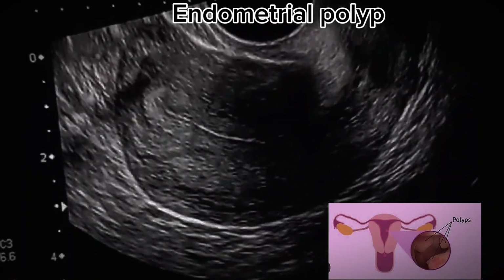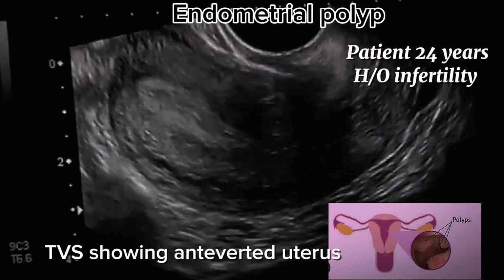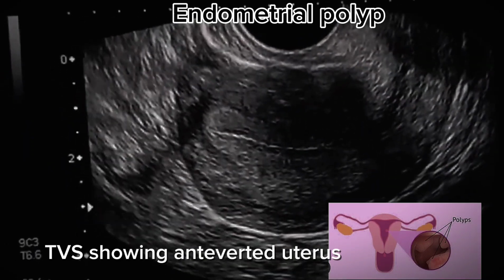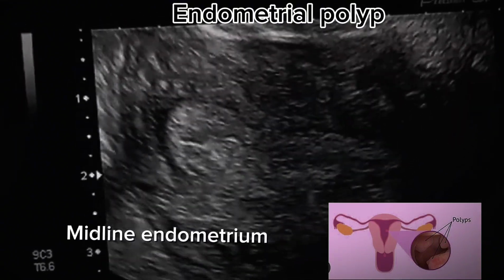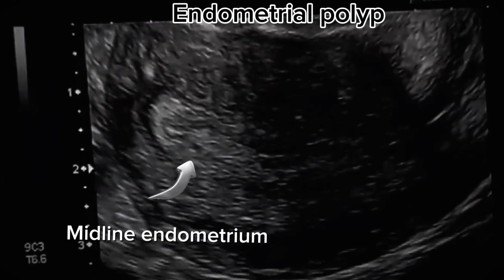We will present a case of endometrial polyp. Patient 24-year-old came with a history of infertility. On TVS scan, that is transvaginal scan, we incidentally saw an endometrial polyp lying in endometrial cavity.